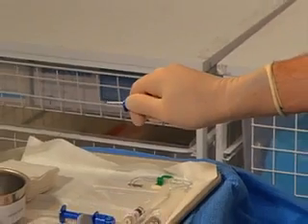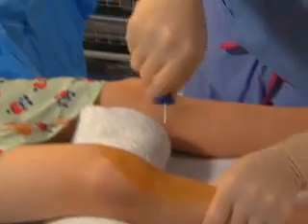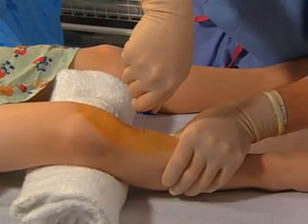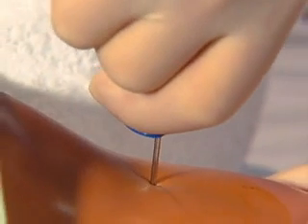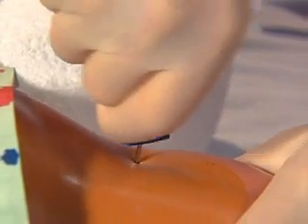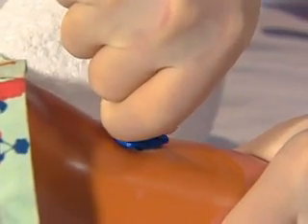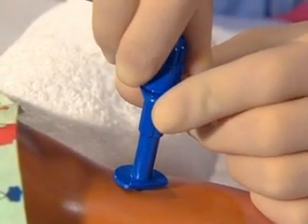Place your thumb and forefinger along the shaft of the needle for stabilization. Place the needle against the skin overlying the site. Puncture the skin and continue through the soft tissue. Use firm, steady pressure and a rotating or coring motion to penetrate the bony cortex. You will note a sudden give with the loss of resistance as you enter the medullary cavity.